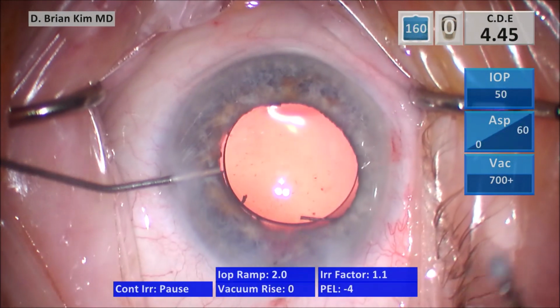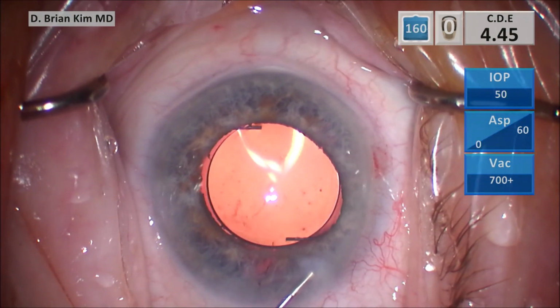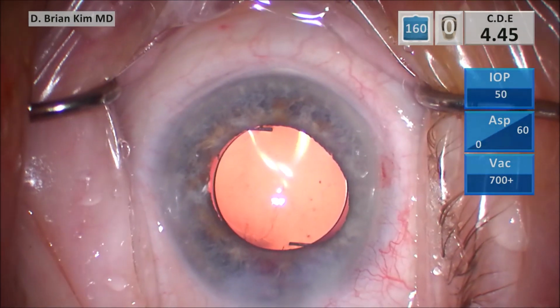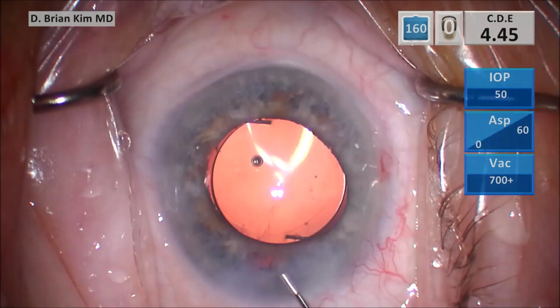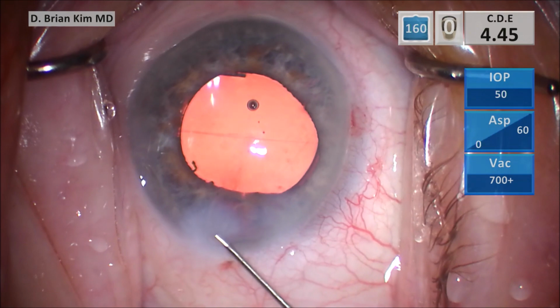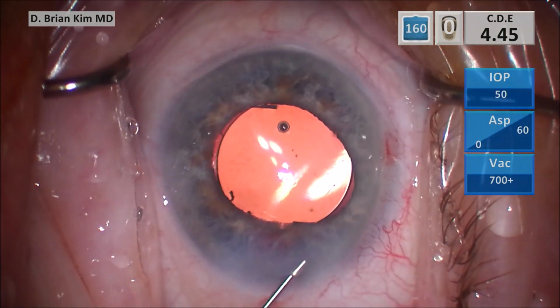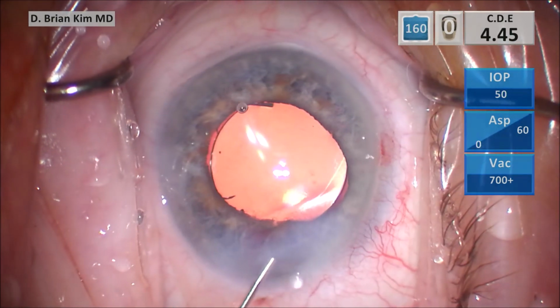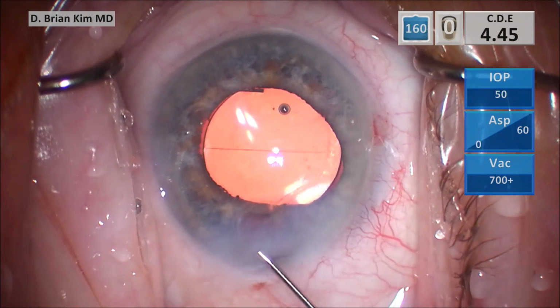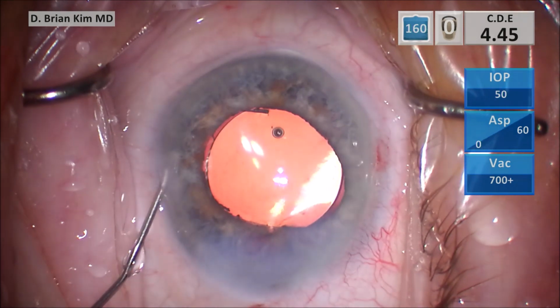Reposited the iris. Again, you have to equilibrate the pressure. When the iris comes out, that means the intracameral pressure is so high during the hydrodissection. When I did it, I decompressed, and then I was able to reposit the iris back. I was able to make a small episcleral stab incision subincisionally, place the single iris hook. Remember that stab incision is still parallel to the iris plane, and so it's a shelved incision, so it shouldn't leak or cause any problems. And even if it does leak, the conjunctiva is covering it, so the risk for a wound-related issue or infection is extremely low.